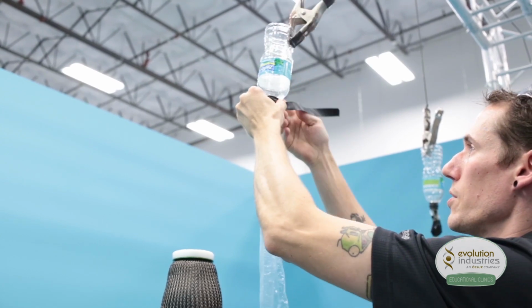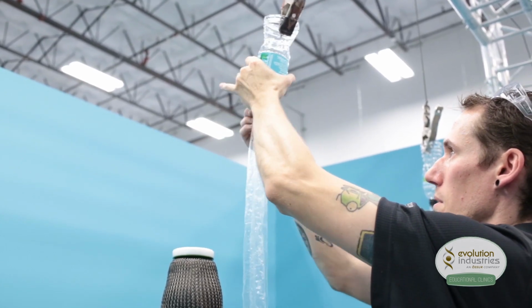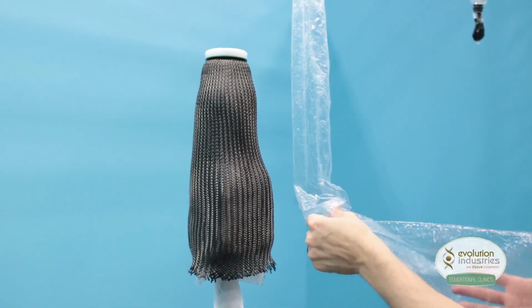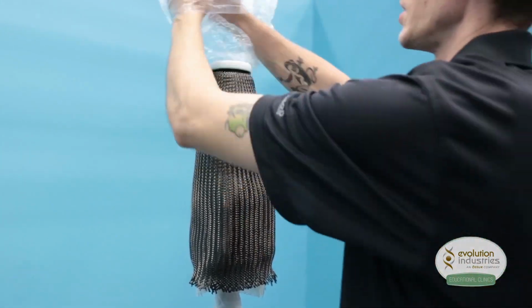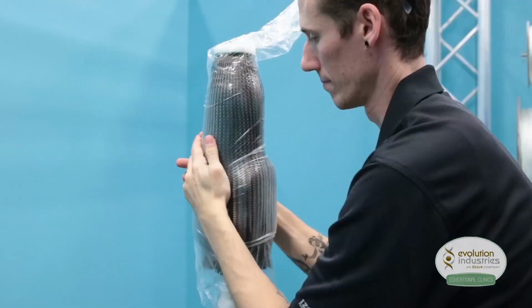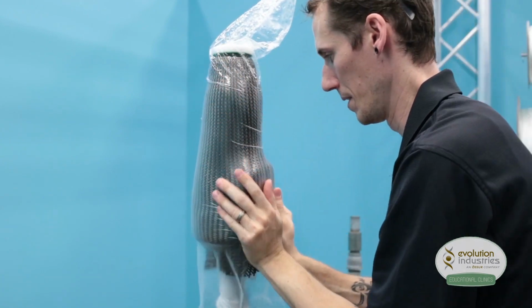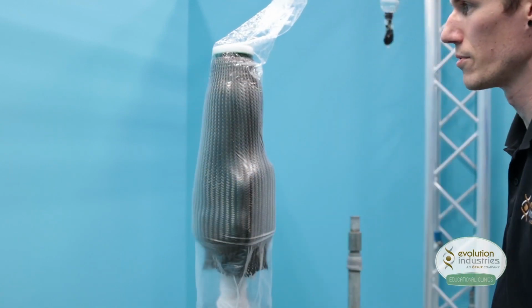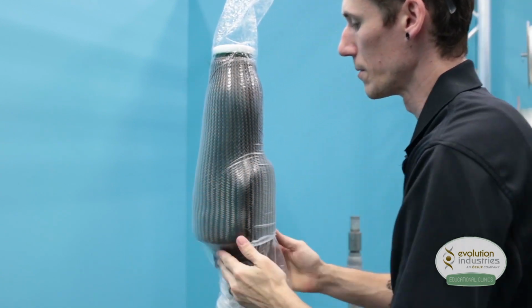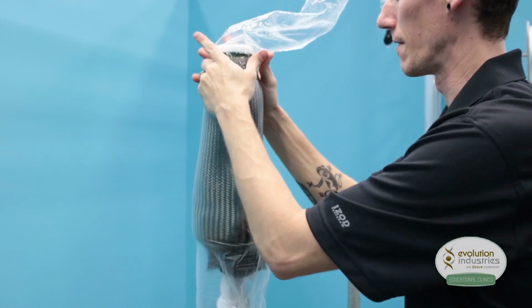Want to make sure we secure the PVA bag to whatever type of funnel we use to prevent any leakage of the resin. And since this is a transtibial, we will put the seam up the posterior. And you may notice we don't use any feather stretch or other thin nylon on the outside. It does make it a little more difficult pulling the PVA bag down, but it gives it a much crisper look to the carbon fiber.